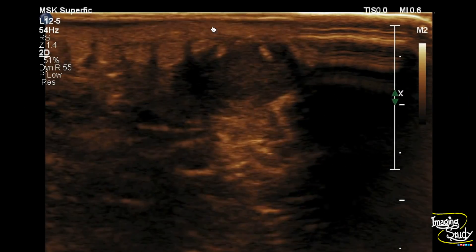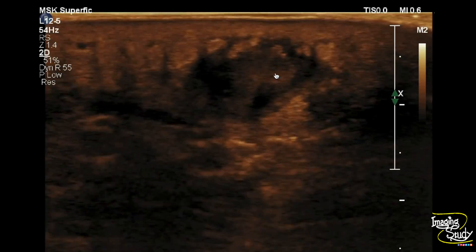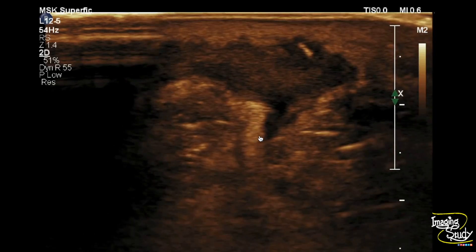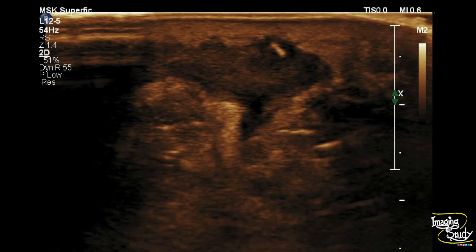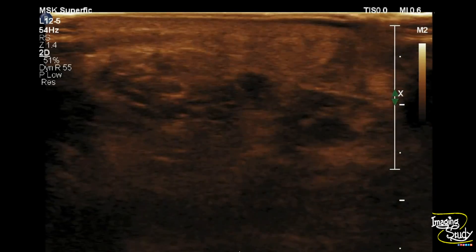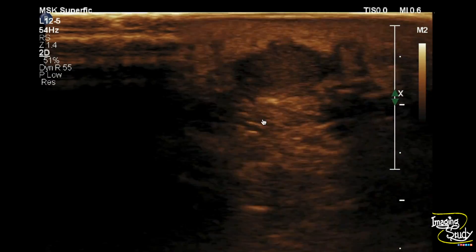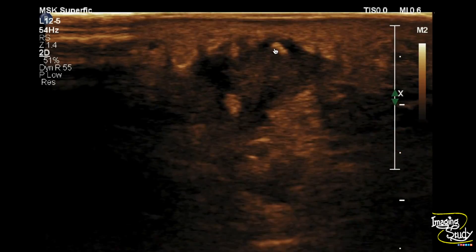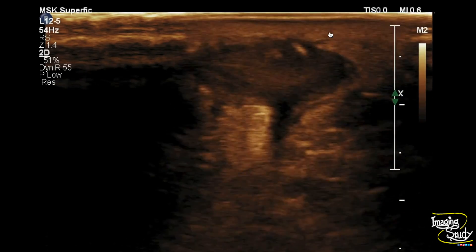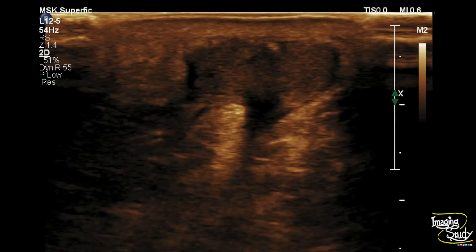Here you can see the high-frequency linear transducer view of the ventral aspect of the foot. You can see a heterogeneous irregular complex area with thick wall within the subcutaneous tissue plane — this is an abscess cavity. If you look carefully within this abscess cavity there is hyperechoic collection, debris, or pus. And if you check more carefully, there is a linear echogenic structure within the abscess cavity. The surrounding irregularity of the fat plane is seen due to inflammatory change.